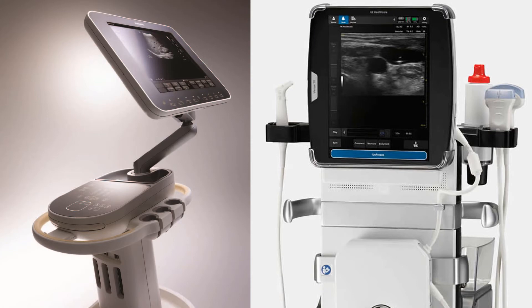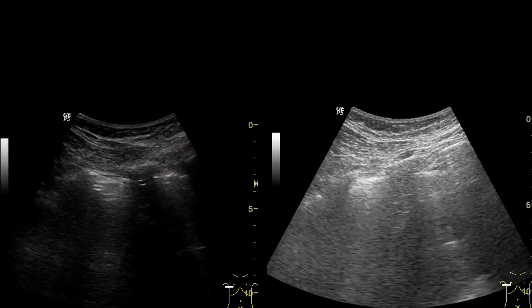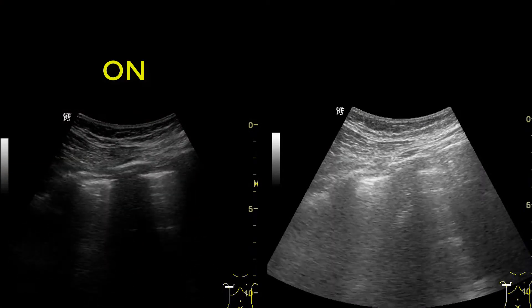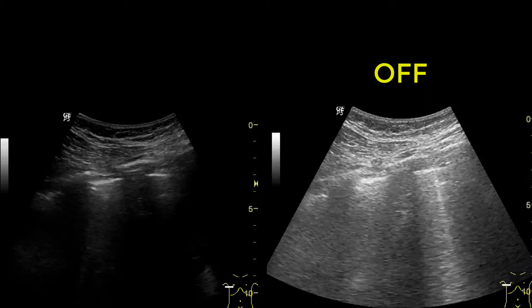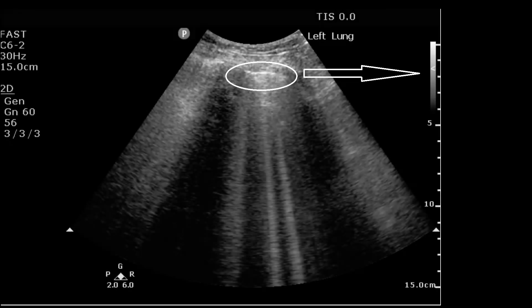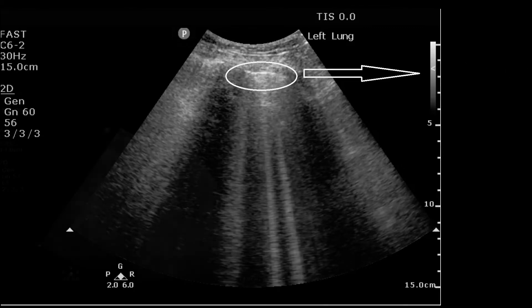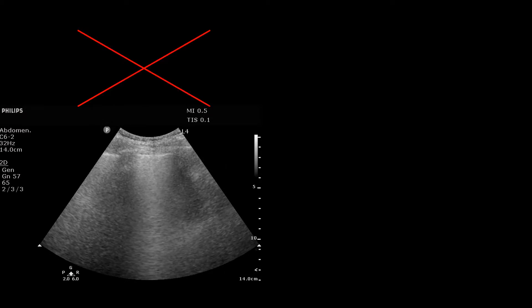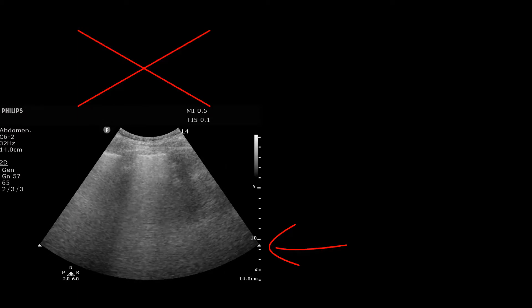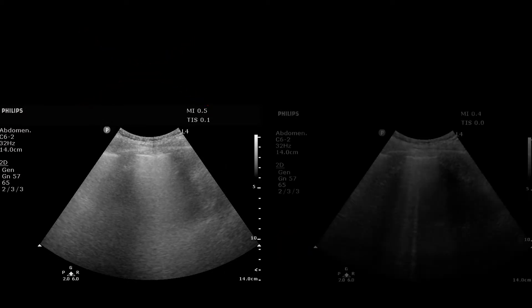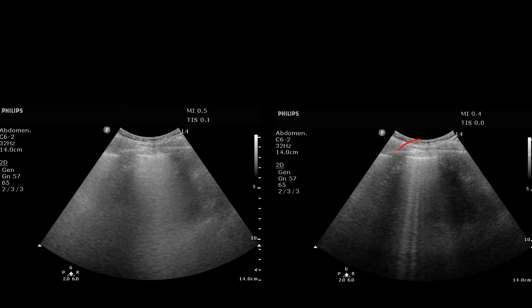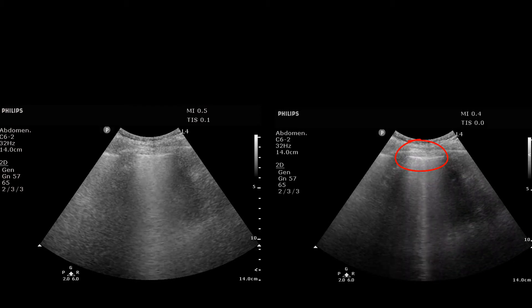Look at the difference between these two loops. First with the filter on, second with the filters off — impressive. Step four: move the focal zone to the level of the pleural line. All lung artifacts are generated at the pleural line, and this will considerably sharpen them. Here the focal zone is too low. In the second image we've moved the focal zone up to the pleural line — look how sharp the B lines are now. Can't miss them.